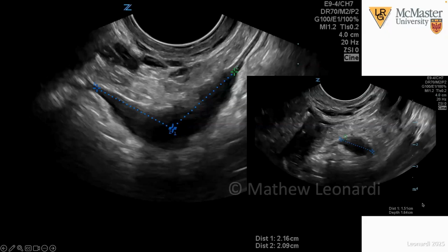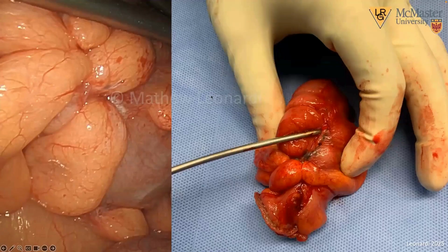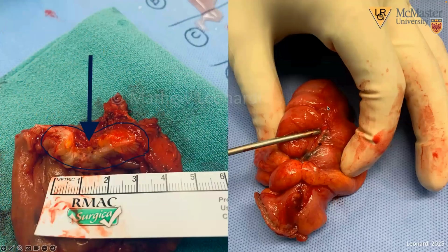But below the surface, we have a very classic sigmoid deep endometriosis nodule within the muscularis layer of the rectum. That's the normal muscularis layer to the top right. And here we have that very thickened hypoechoic muscularis layer. This lesion is nearly 4 centimeters in its length. So we committed to doing an anterior resection for this patient. And as you can see, when we start to peel those epiploica off of the rectum, that endometriosis is visually, grossly revealed. We knew it was there. And when we cut that lesion in half, it looks almost exactly like the ultrasound image as well. It's got that retractile nature within the muscularis layer.